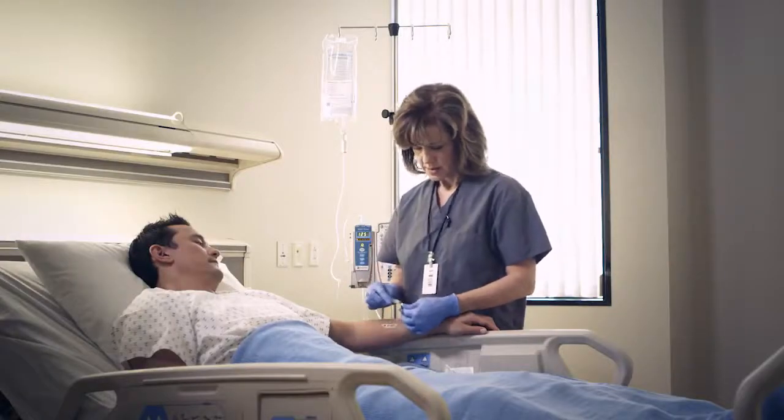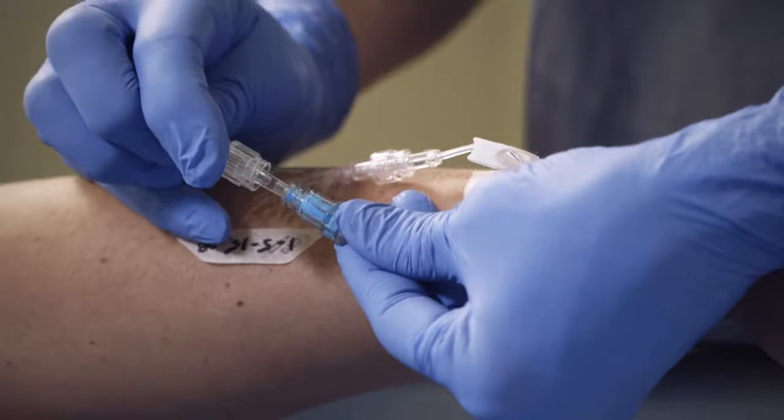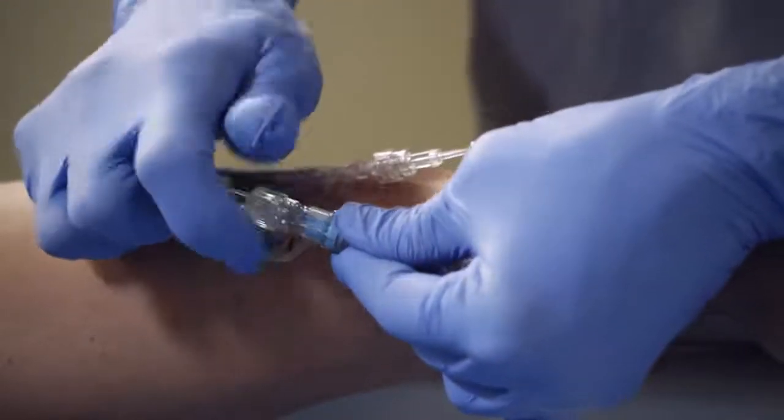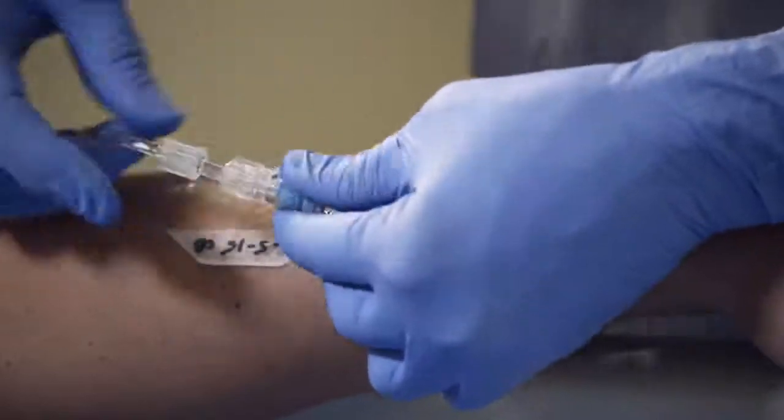If the mating luer is a two-piece spin collar, pull back the collar, insert the luer with a straight-in motion, and rotate it one-quarter turn clockwise before tightening the spin collar.